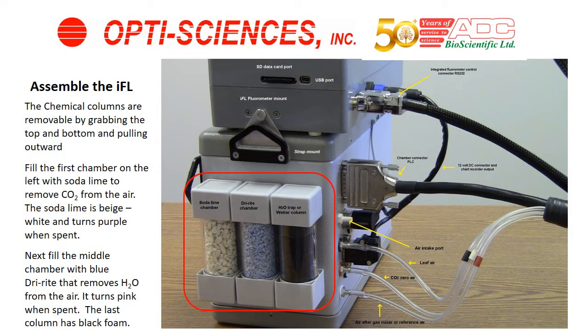Next, there are three ports on the side of the LC-PRO SD for chemicals. One is for sodalime, which is white and when spent turns brown. One is for dry-rite in the middle, which takes the blue chemical and turns purple or pink when spent. And then there's an H2O trap, which has foam pieces inside the column. Each one of the chambers has O-rings.